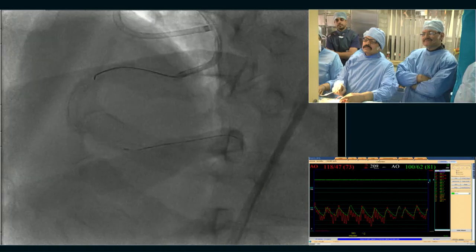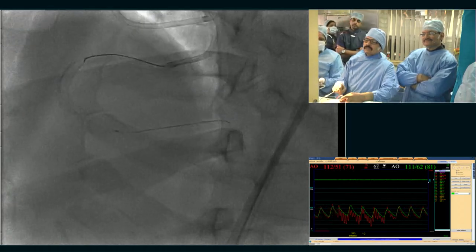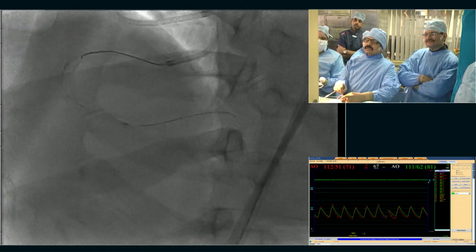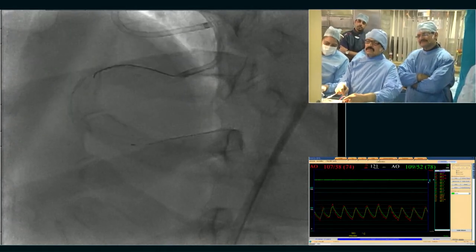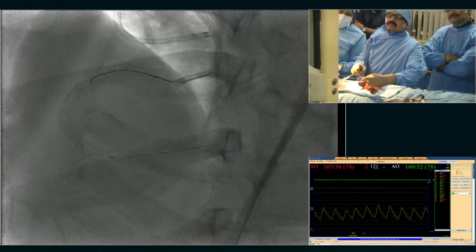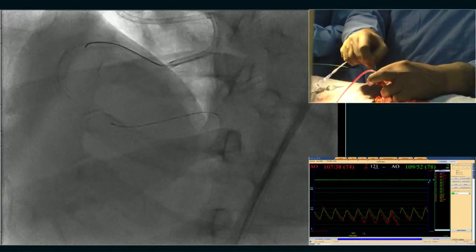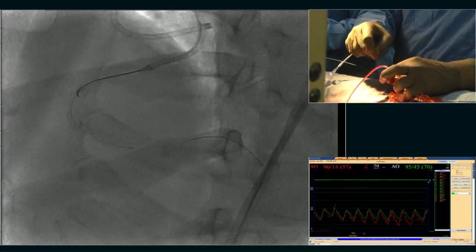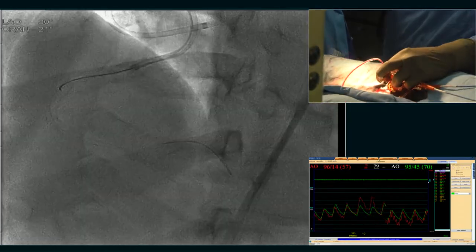But just inflate the balloon a little bit. There's another technique we use. Be careful with your guiding catheter. Then we'll push a little, keep it inflated at 3-4 atmospheres, then I'll push the balloon. Sometimes that will work out. It is a very hard calcific lesion, multiple layers of stents. I think if it is retrogradely filling, I'm happy with that.